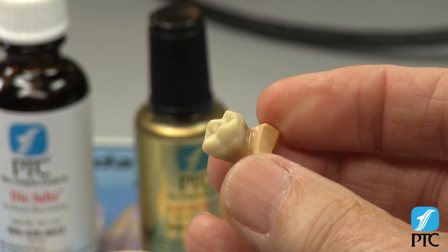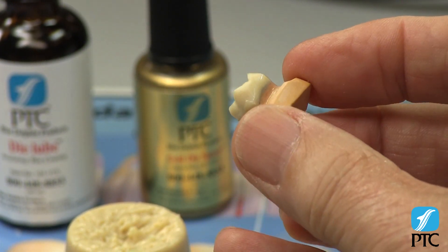If the excess wax fills the undercut, stop and remove the wax, then repeat the sealing procedure.